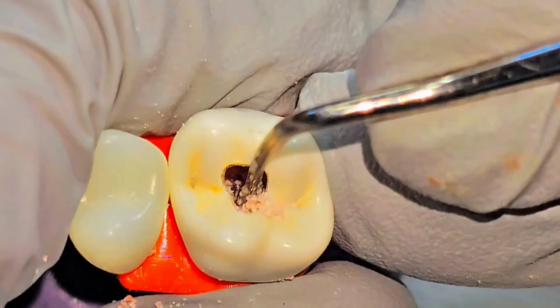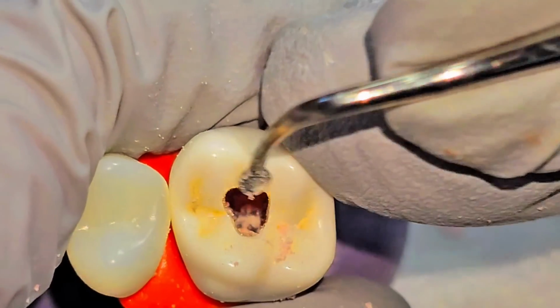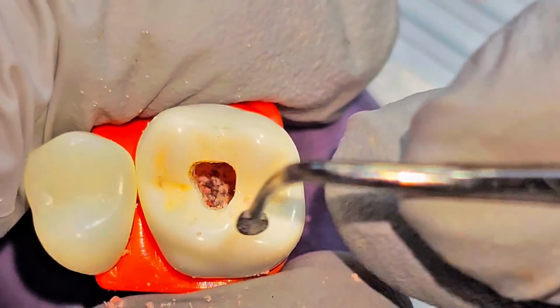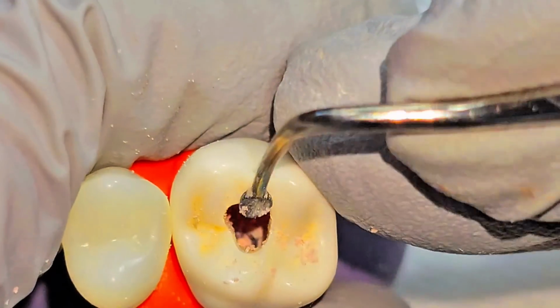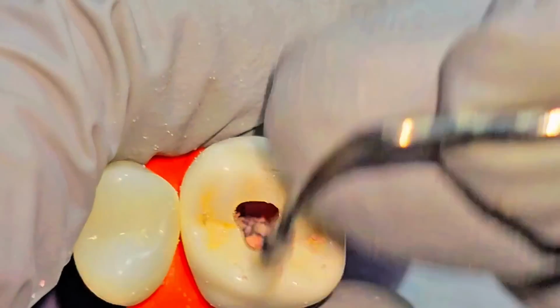So probably using the 330 burr might be safe because it just stops right away. But it leaves some burn mark, but because that is just the initial and a very small opening, probably that could be a good tip.